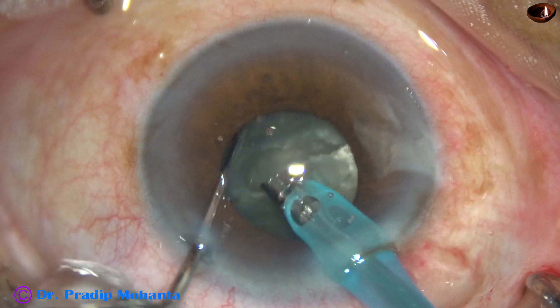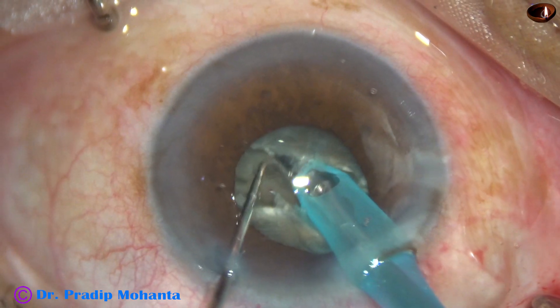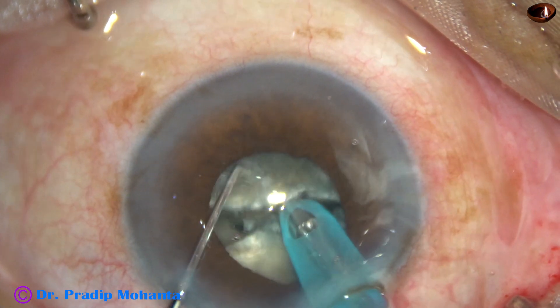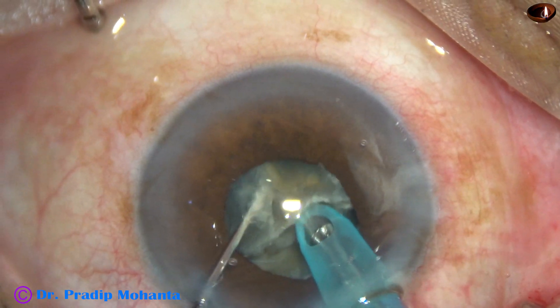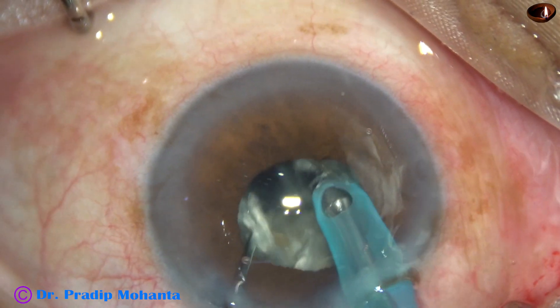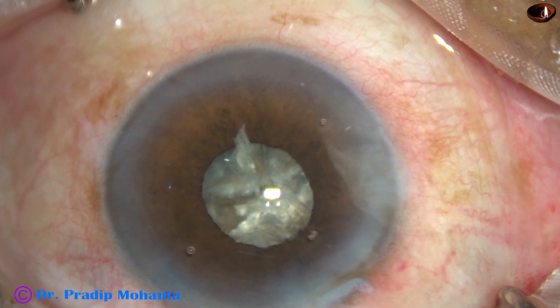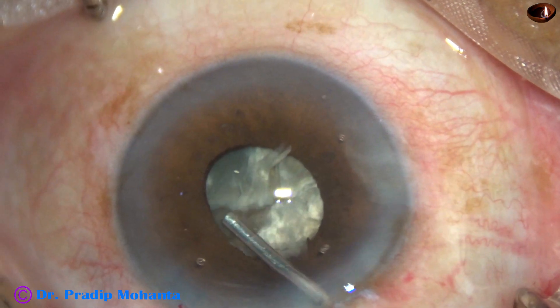Rotate it 180 degrees, come to the opposite side, hold one hemi-nucleus and separate the two hemi-nuclei completely. I see that the pupil has constricted too much. However, I am dividing one hemi-nucleus and I have been able to do this. Now the pupil has constricted to a dangerous level because the cataract is very hard, and if I continue, most of the steps will be without seeing, and that will be dangerous for the patient.